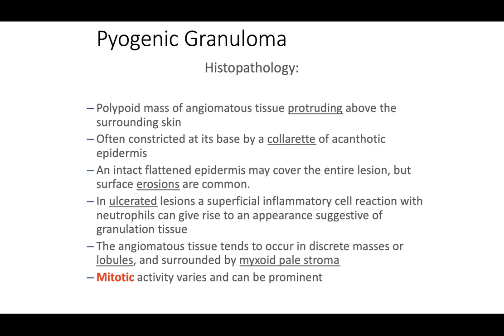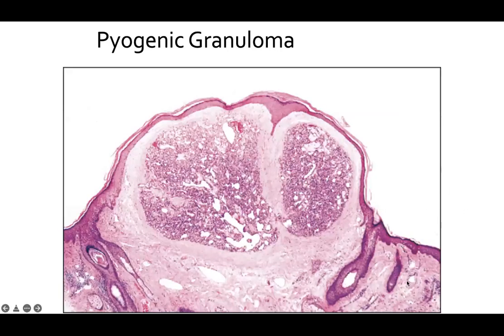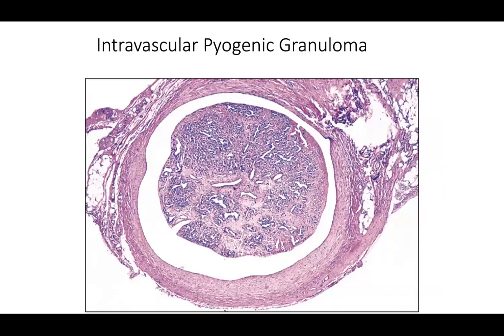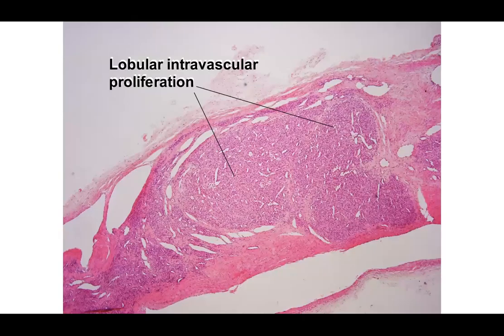The angiomatous tissue tends to occur in discrete masses or lobules, often with a surrounding myxoid pale stroma. Mitotic activity varies and can be prominent. Here you see the collarette wrapping around the lobular capillary hemangioma; on higher power you'll see lobular architecture composed of very thin-walled spaces and endothelial cells. Mitotic figures are frequently found in these lesions. You can also have an intravascular pyogenic granuloma, which looks like a lobular capillary hemangioma but is within a vascular space.